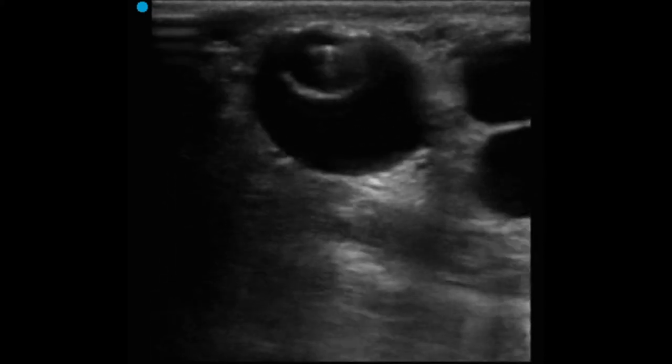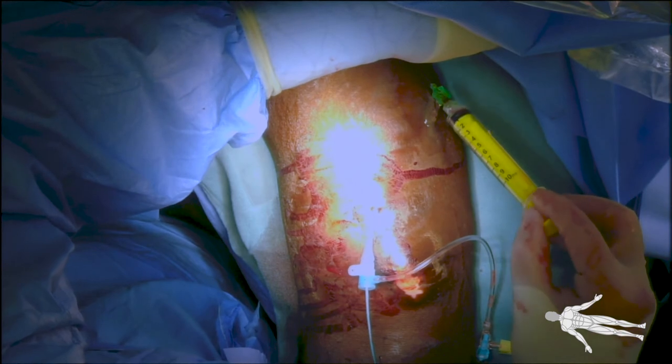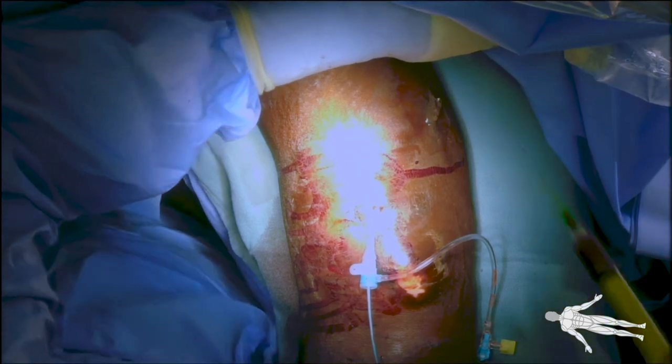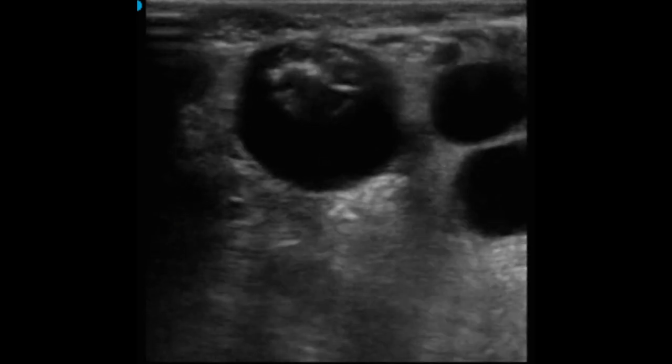Therefore, the balloon position was accurately determined using a combination of fluoroscopy and ultrasound imaging. Using ultrasound, we accessed the tip of the balloon using a micropuncture needle and aspirated the contrast, allowing for complete deflation of the balloon as seen in this portion of the video.